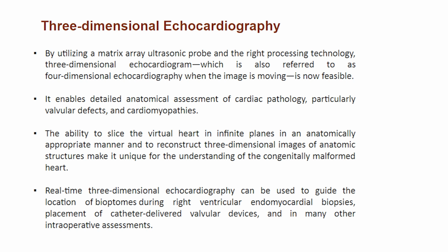Real-time three-dimensional echocardiography can be used to guide the location of bioptomes during right ventricular endomyocardial biopsies, placement of catheter-delivered valvular devices, and in many other intraoperative assessments.